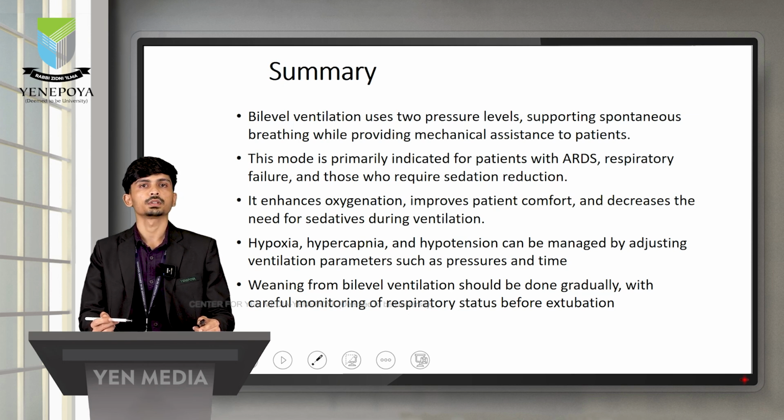But one thing you have to keep in mind is that you have to monitor the patient continuously. Every second hour, once you have made a change, you have to monitor the patient. If there is any clinical deterioration, you might want to change the settings back to how they were before, and then only try again slowly.